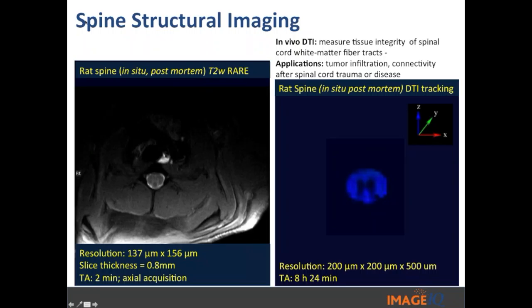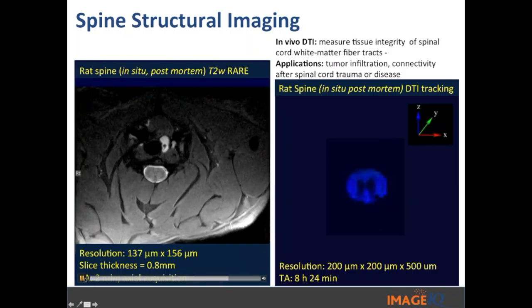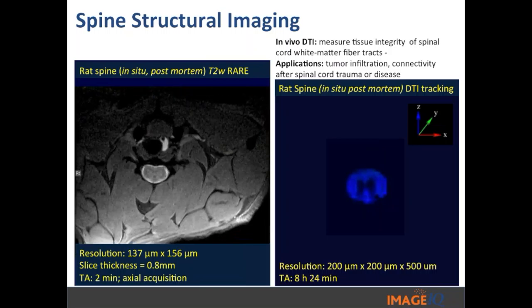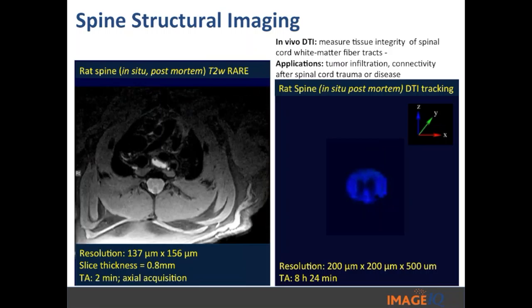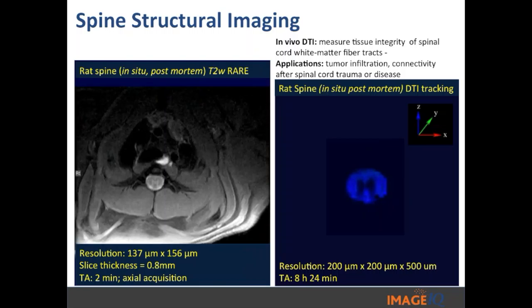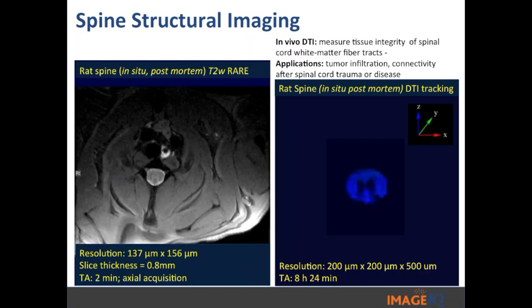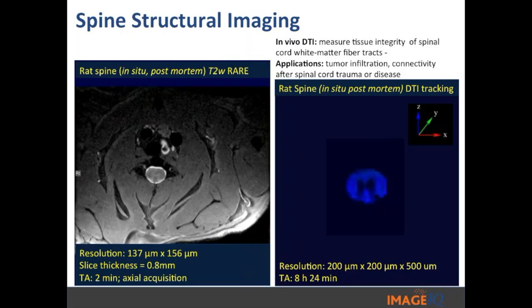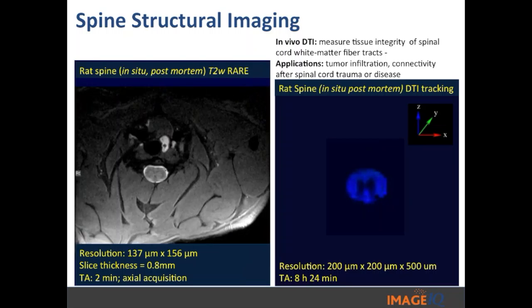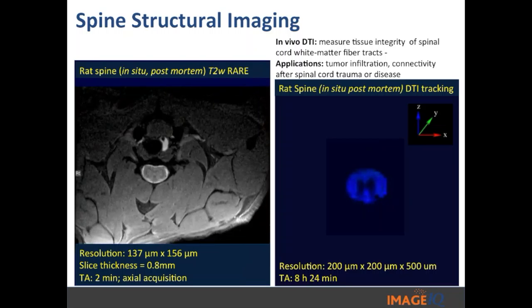Here we have another example combining structural imaging and diffusion tensor imaging. This group has a spinal cord injury model they're interested in eventually quantifying. To the left is a video of the spinal cord — the acquisition took about two minutes — to look at general structure and white matter. The DTI to measure tissue integrity of the spinal cord white matter track took eight hours and 24 minutes because of the high resolution required to determine the extent of disconnect along the spinal cord.